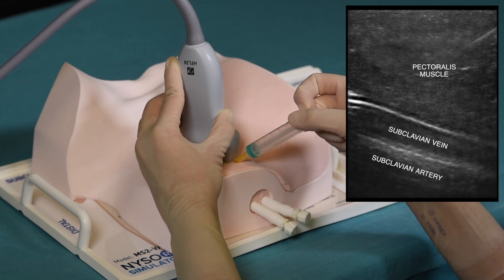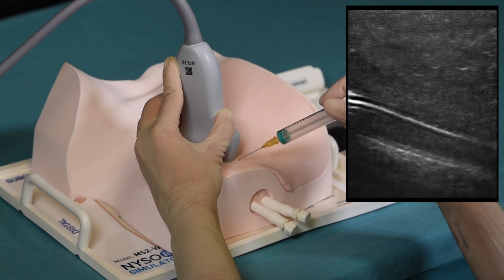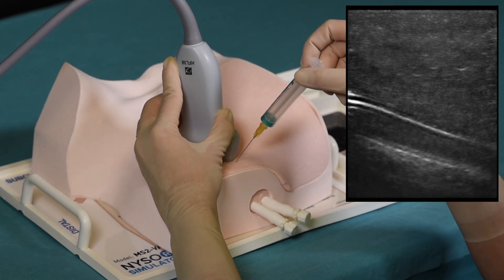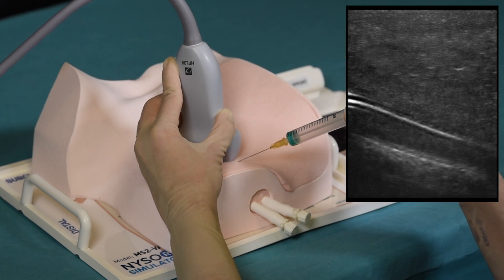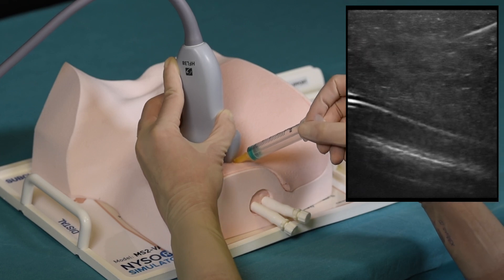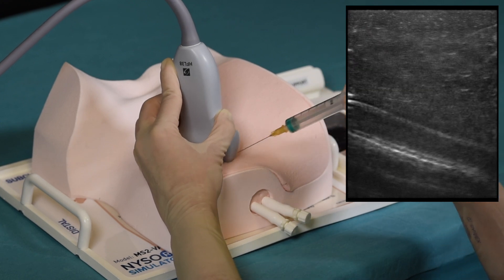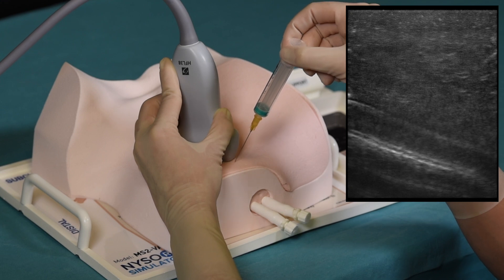The needle is inserted in-plane to reach the subclavian vein. In this example we are using a smaller needle gauge to extend the life of the simulator; in actual practice an 18 gauge needle would be appropriate. We can see the needle approaching the subclavian vein and then withdrawing to assume a steeper angle in order to actually reach the vein. This process requires a great degree of practice before approaching an actual patient.